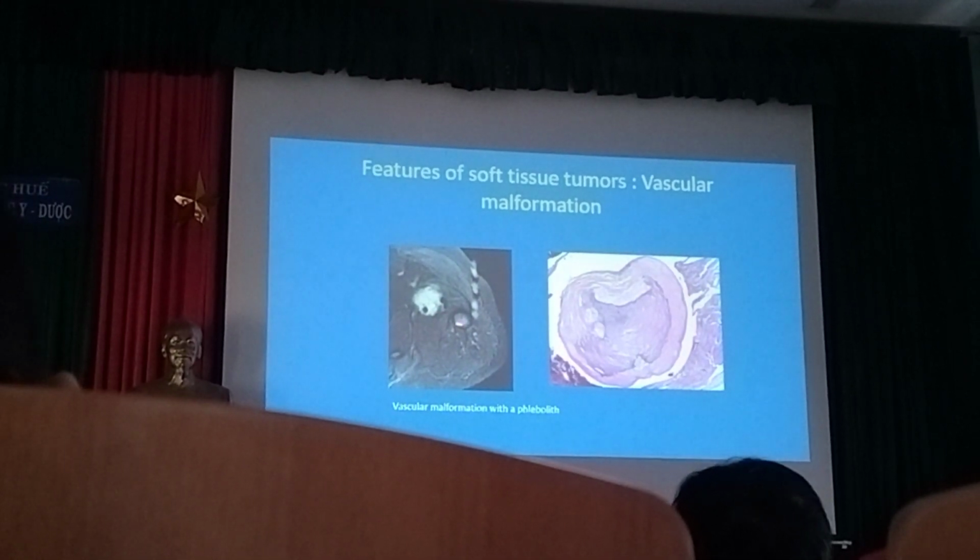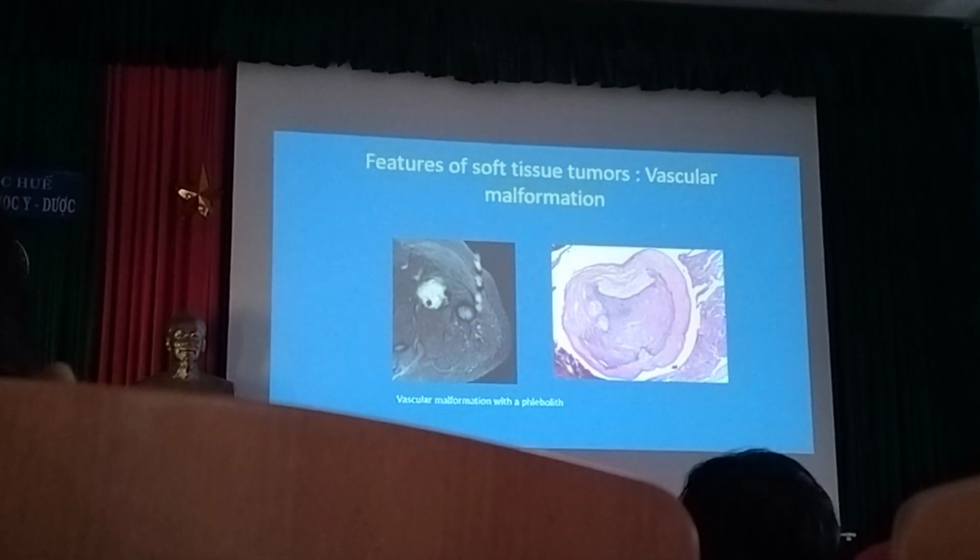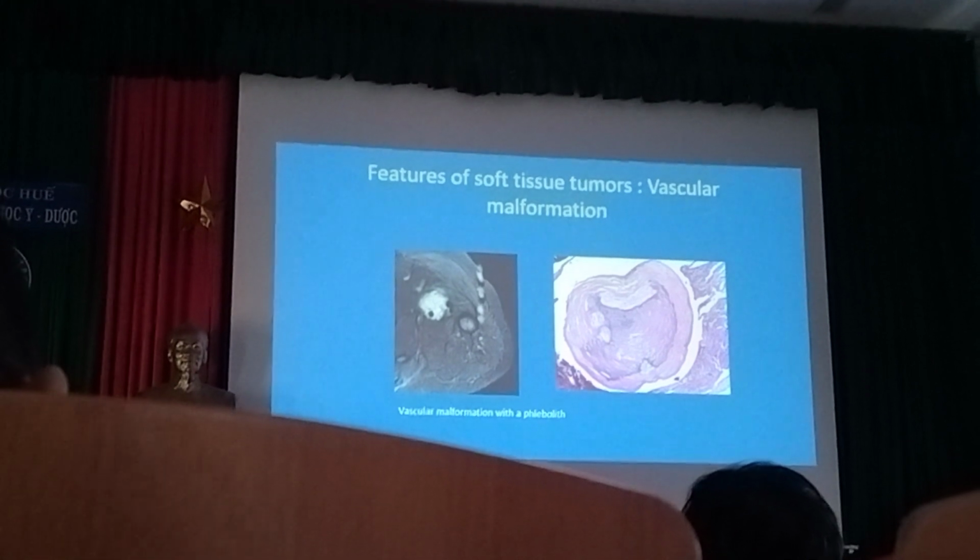Okay, and this is to show you the thrombosis inside. So this is the clotted blood in the channel.